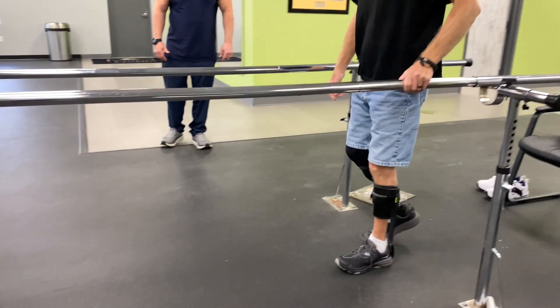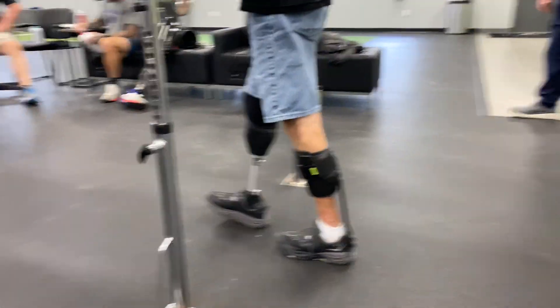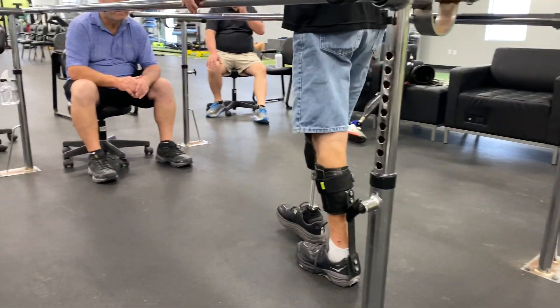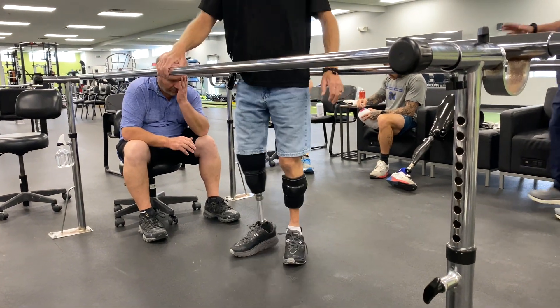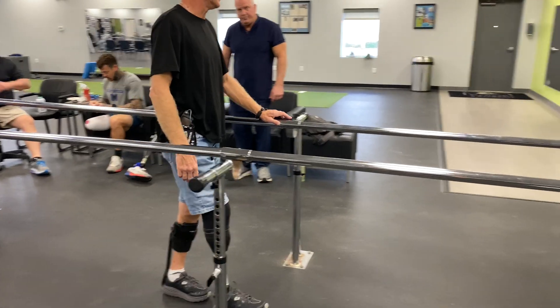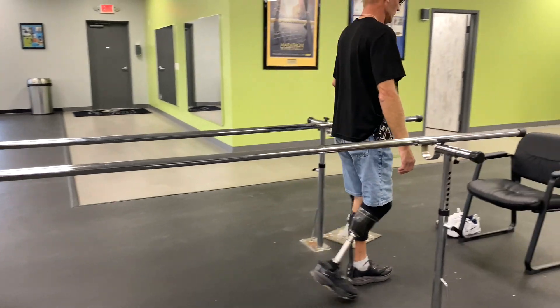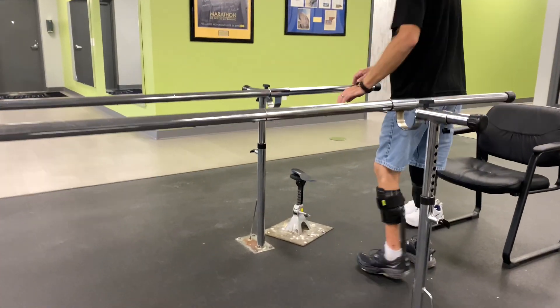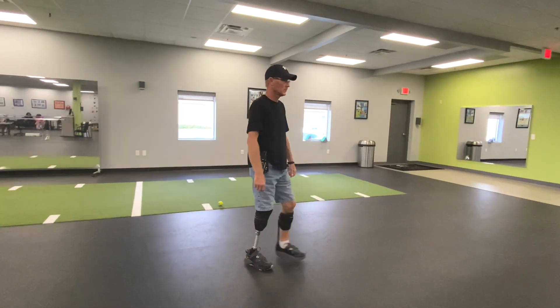Now it feels about the same. He basically had the same thing — foot drop — and that was all because the tendons didn't have anything to anchor to. Did you hear what he said? That's because the tendons in his foot had nothing to anchor to. So once you get used to it, go ahead and pick up your speed.